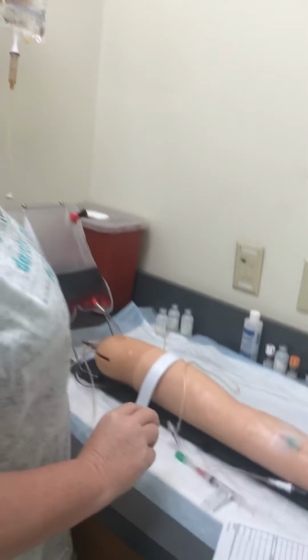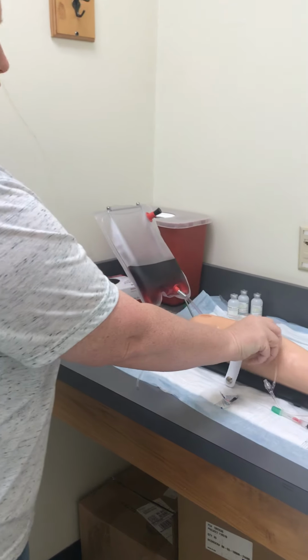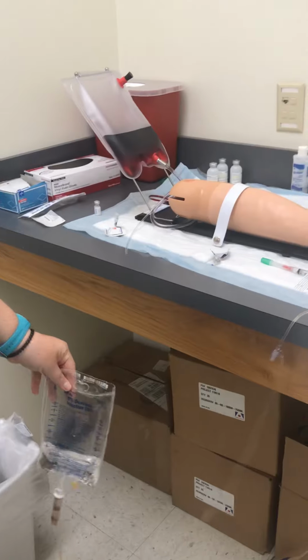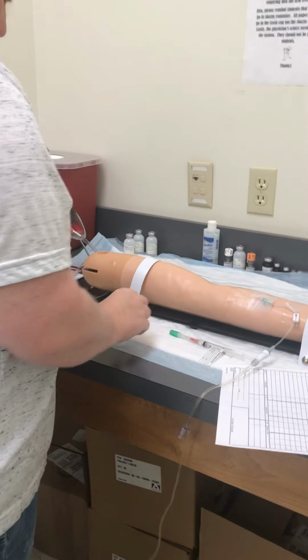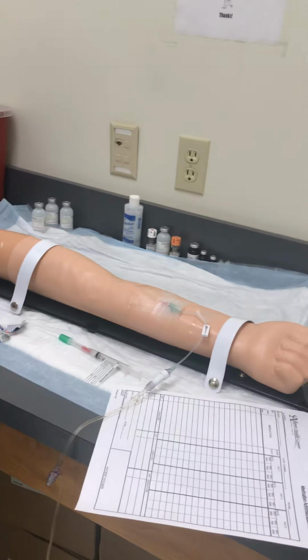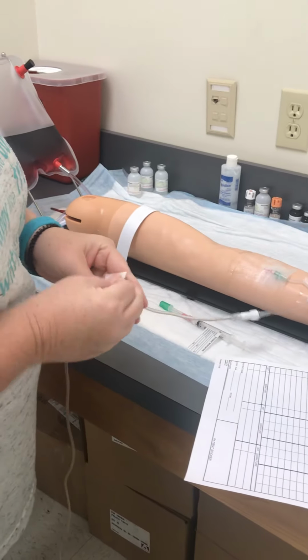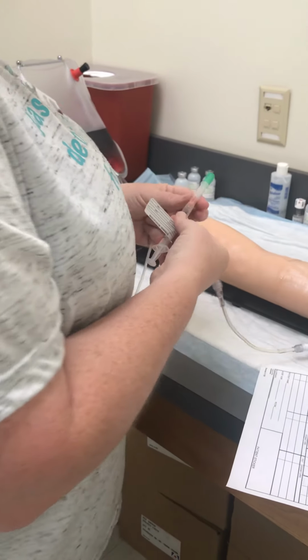I'm going to check to make sure my line is good, so I'm going to lower it. And it's good. So, I'm going to clean that again. Okay, we're going to clean. Alright, we're ready to give him this.